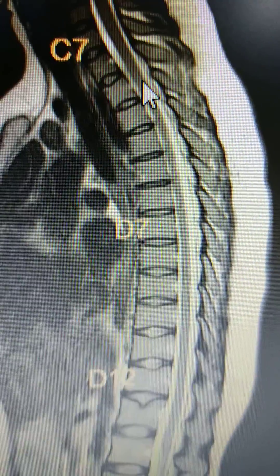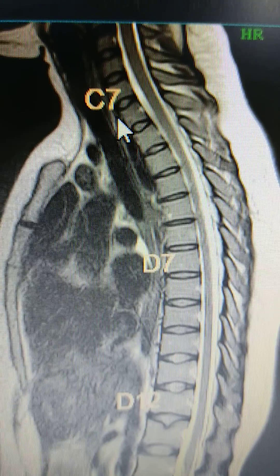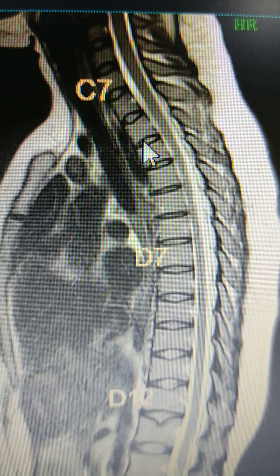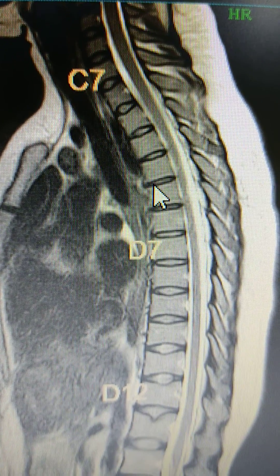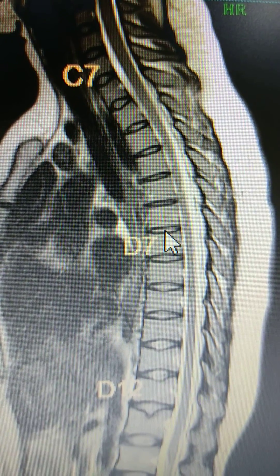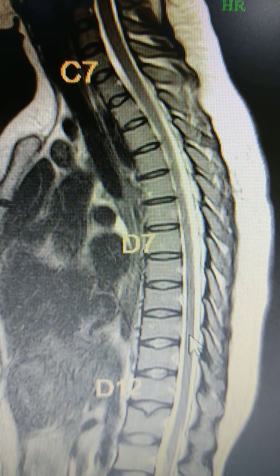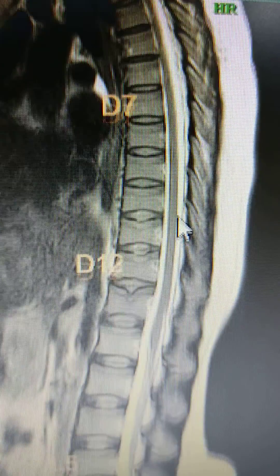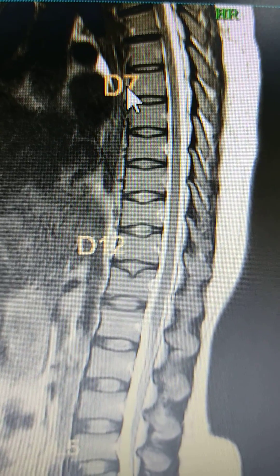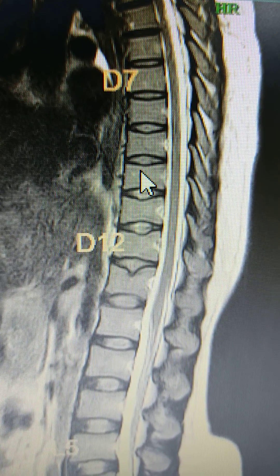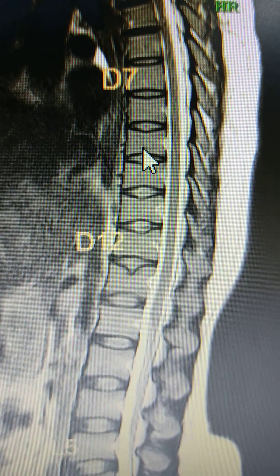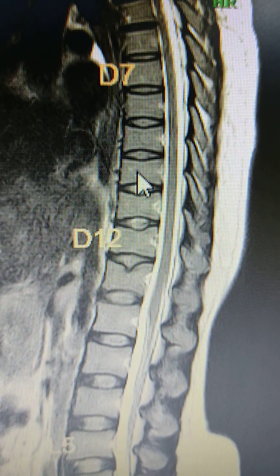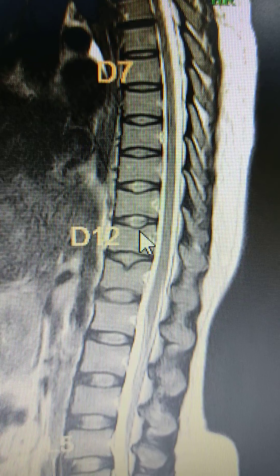Continuing down: D1, D2, D3, D4, D5, D6, D7, D8, D9, D10, D11, D12.